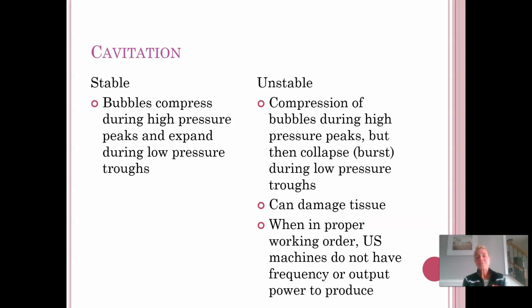And actually, if you perform ultrasound in water, which we will talk about later, you can see some of the bubbles that will form with that. Bubble formation is normal during an ultrasound treatment. They're going to compress during high pressure and expand during low pressure trough. So as that crystal is expanding and contracting and introducing different frequencies of energy into the tissue, you're going to have bubbles that form that compress and expand. That is normal. That is stable cavitation.